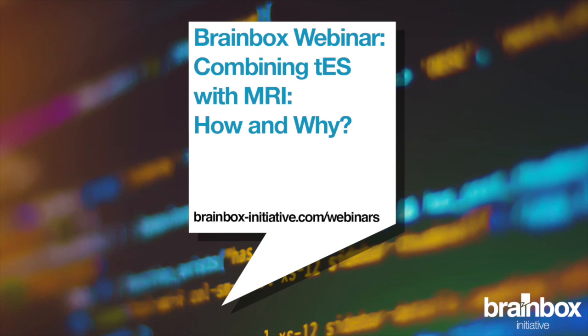So we have used TMS. We have looked at the effects of TMS on various things. We've always done that by scanning, getting them out, doing the TMS, and putting them back in again. And that's fine. But there are definitely groups around the world that are doing TMS in the scanner, but it is really hard.